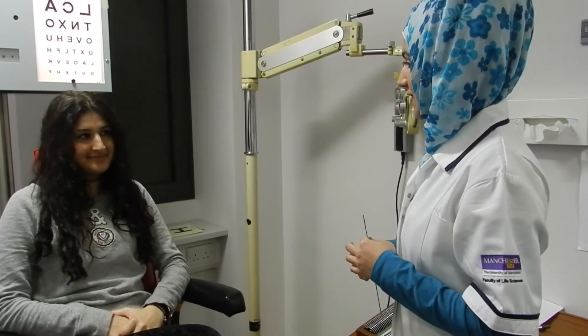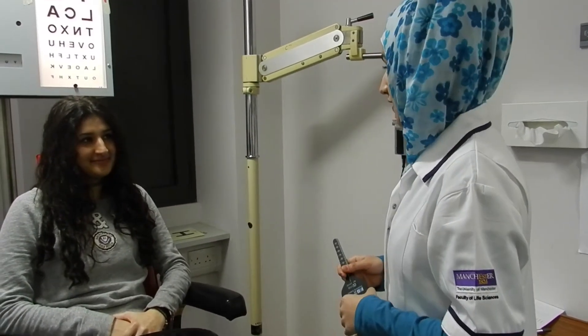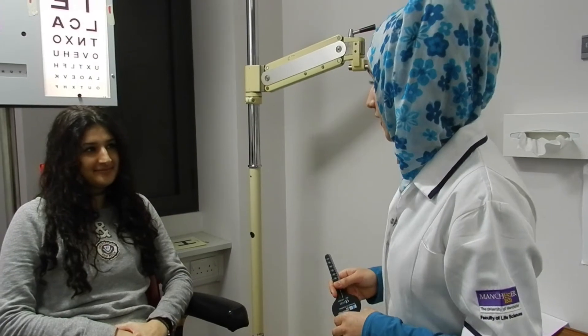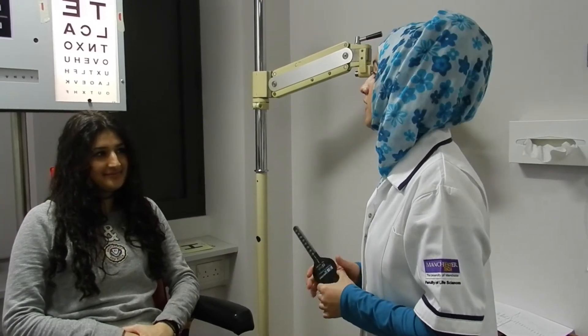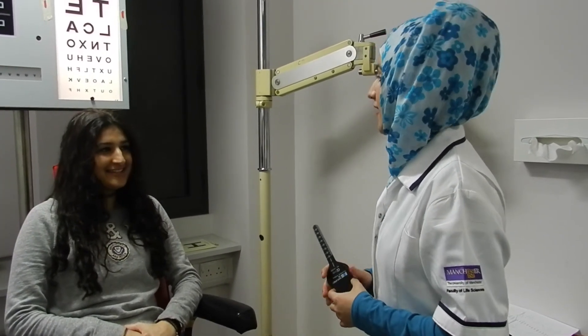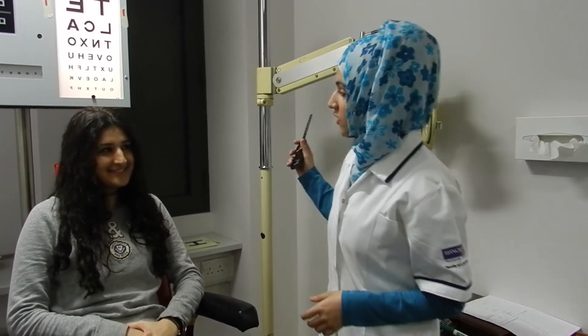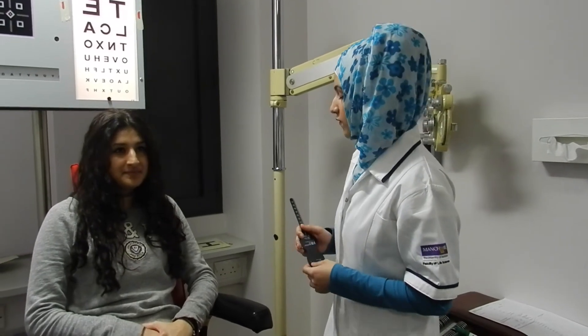Hi, my name is Arisa Said. I'll be your apprentice today and I will be testing your eyes and seeing how the eye muscles work together in particular. How are you today? I'm fine, thanks. Can you see everything in the chart over there? Yeah, I can. Are you comfortable seated? Yep.